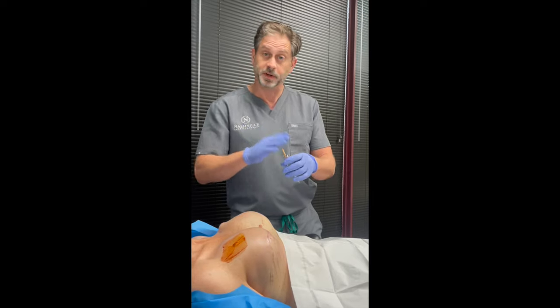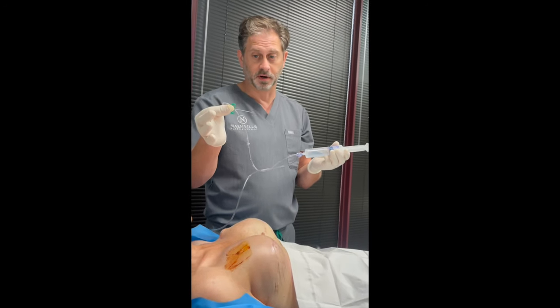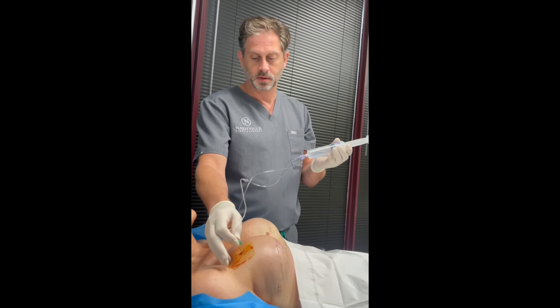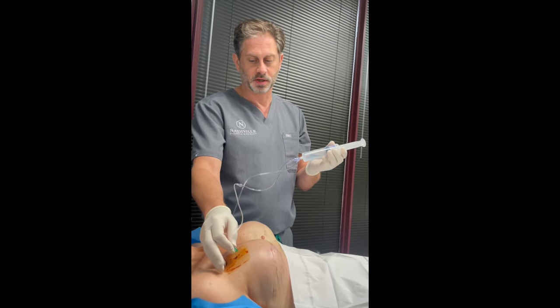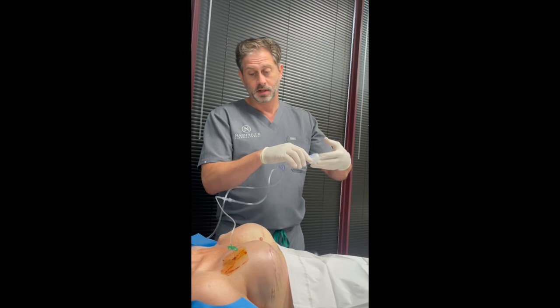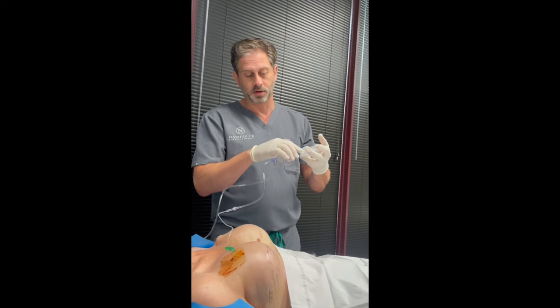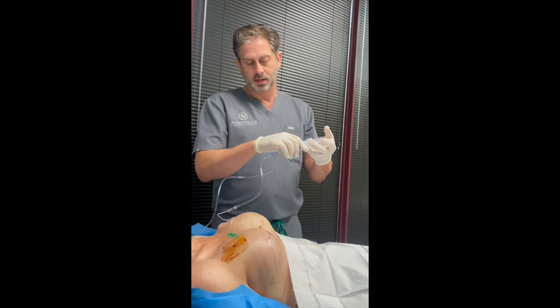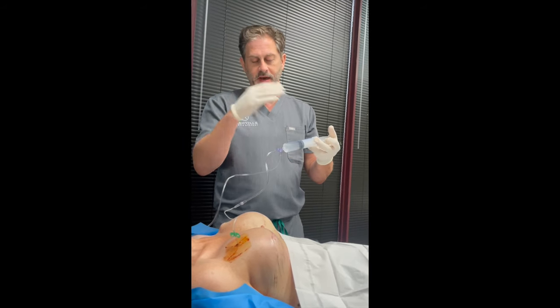Now we just take a small butterfly needle and find that injection port. There's a small little twinge maybe as it goes in, but that's the extent of it. Now we just expand — they expand slowly, and you often don't exactly see it as it's going in, but sometimes you can see the difference at the end of that single expansion.